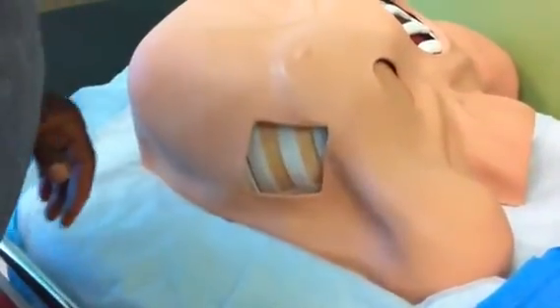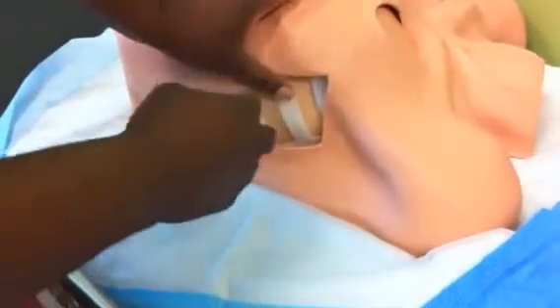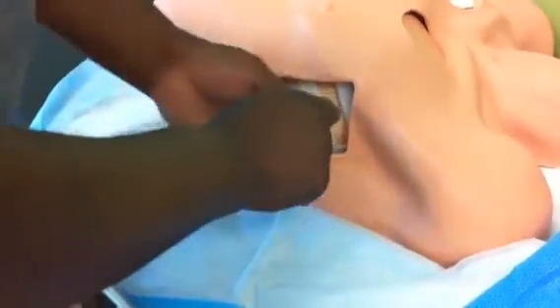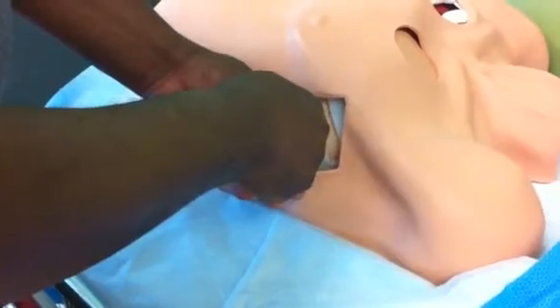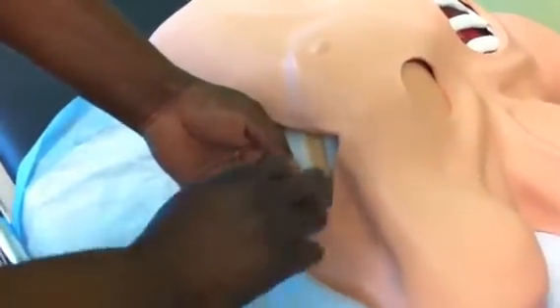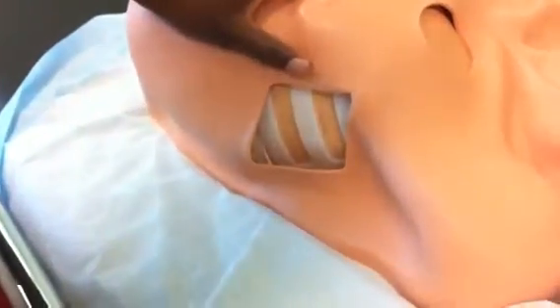Then I get my lidocaine or xylocaine and infiltrate the skin as local anesthesia, and then go in a little bit further — going above the rib so that I don't hit the neurovascular bundle — and then infiltrate a little bit more. Once I get into the space, if I see bubbles or fluid come, I can infiltrate some more.